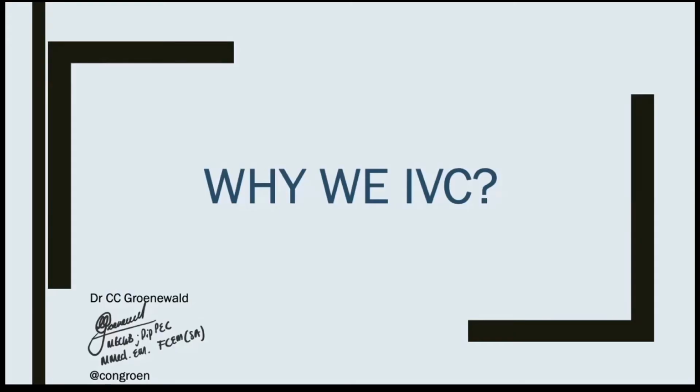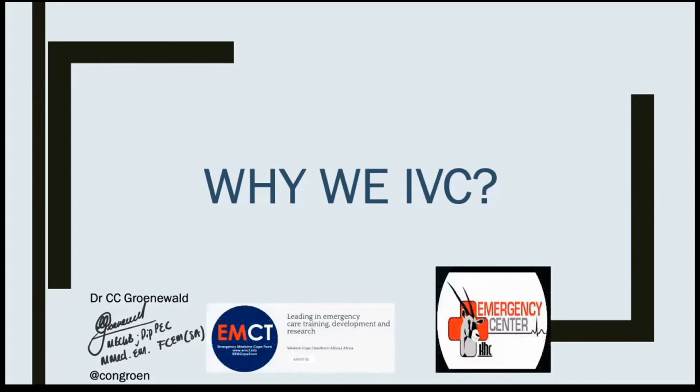Okay, so thanks for that introduction. So what I'm going to talk about is, after you get those views, if you can get those beautiful views, why do we do them, and how do we interpret them? And are we good at it? Are we bad at it? And when are we really not sure? And so just a background, like I said, my previous places where I worked was Cape Town, and I was a consultant in Kimberley, and we had that cool sign.